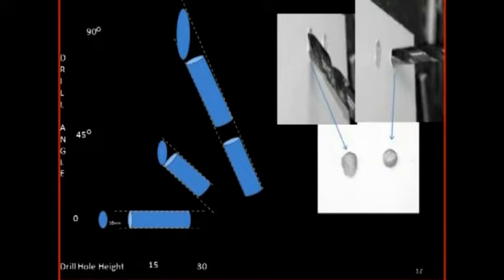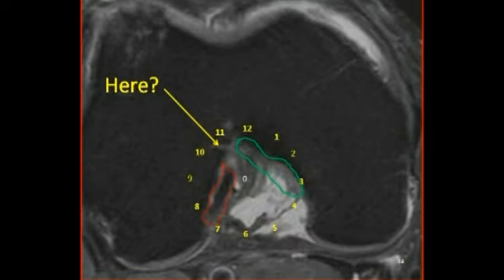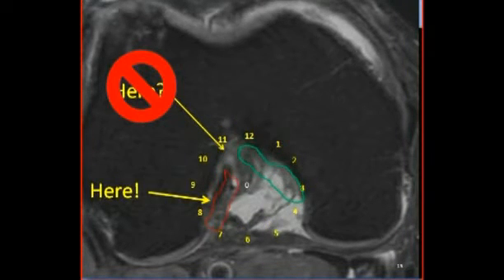A transaxial MRI view, somewhat distal to the femoral ACL attachment, shows the posterior margin of the ACL immediately adjacent to the posterior articular margin of the lateral femoral condyle. If the drill is directed to the 11 o'clock position, it will miss the ACL attachment site. The proper drill site is at around 8 o'clock, not 11 o'clock. Note that, in order for the drill to reach it from the level of the joint, it must be nearly horizontal.